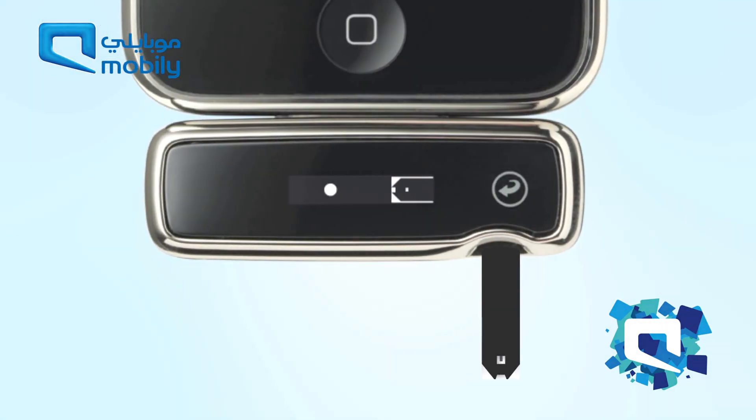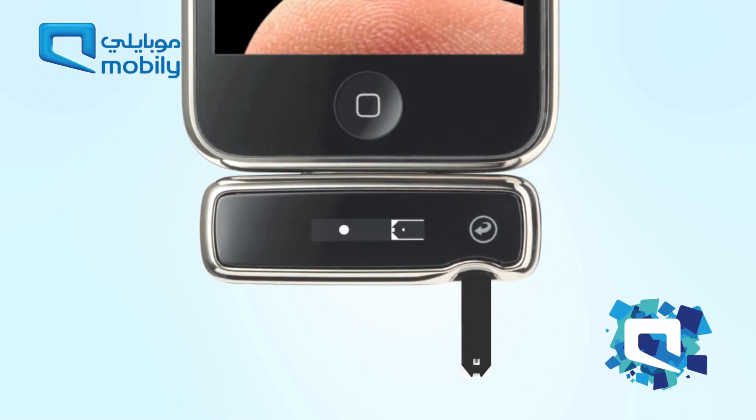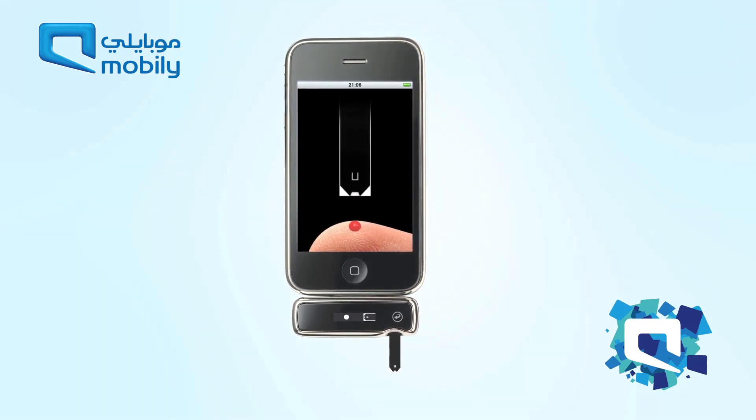The meter will now display an apply sample animation, one of the many features that makes IBGSTAR so easy to use.